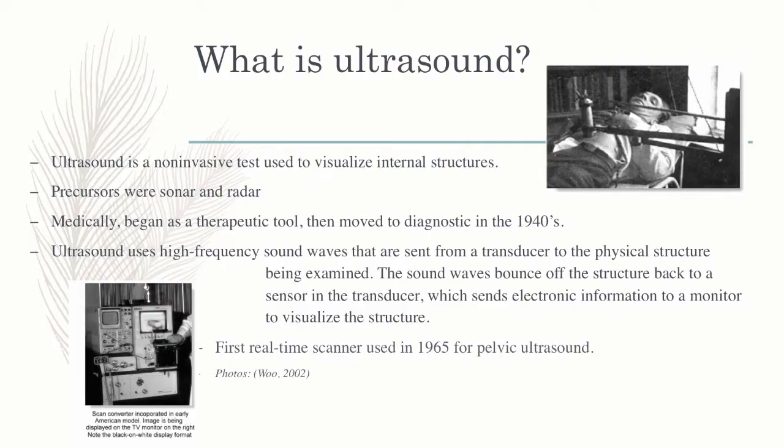So first of all, what is an ultrasound? An ultrasound is a non-invasive test used to visualize internal structures. The precursors of it were sonar and radar used for underwater locating of structures. So medically, it began as a therapeutic tool, then moved to diagnostic tool in about the 1940s. It uses high frequency sound waves that are sent from a transducer, bounce off something, and come back to the transducer and eventually produce an image.